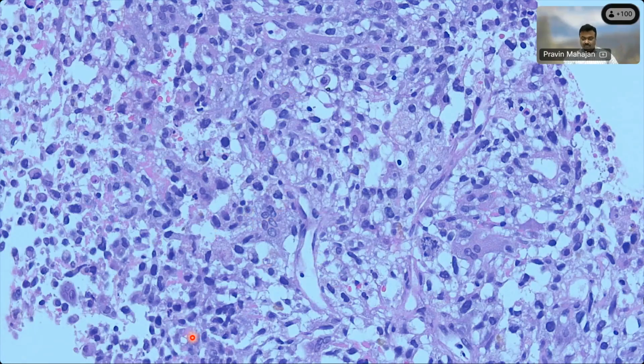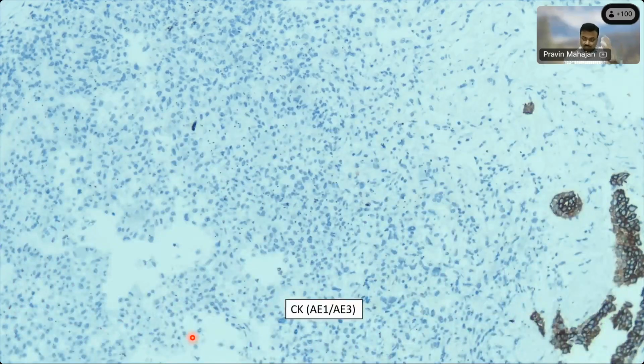So it looks like a malignant tumor definitely. Has got this spindle and epithelial morphology, very pleomorphic looking. And then obviously the differential will be whether it is a metaplastic carcinoma or whether it is a malignant phyllodes tumor. Okay, so you do the markers again to prove the point.